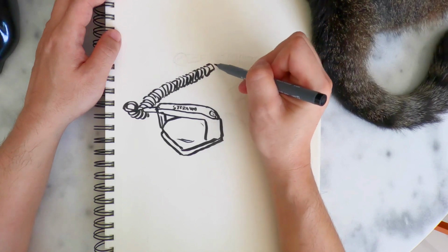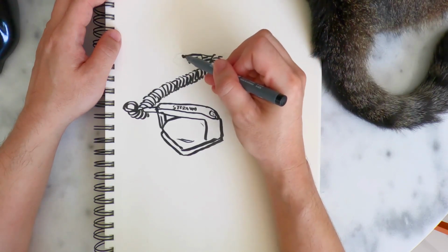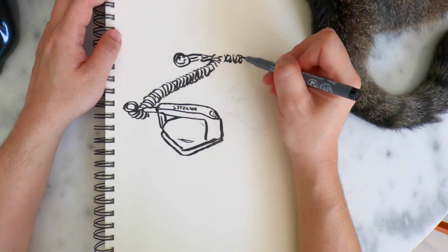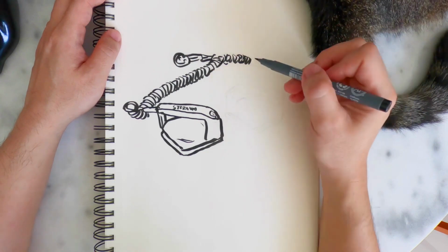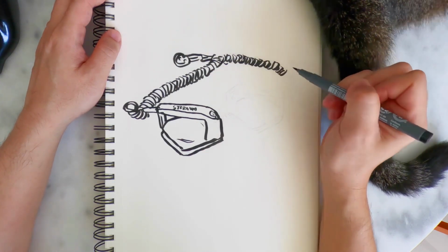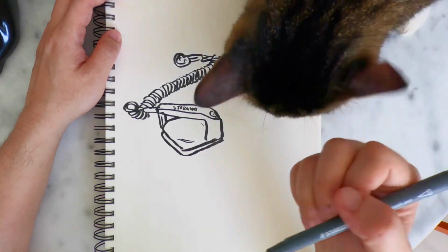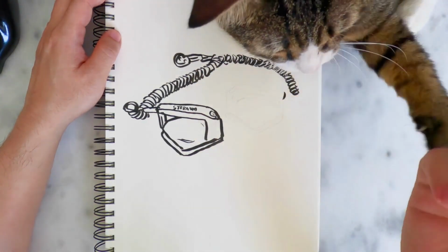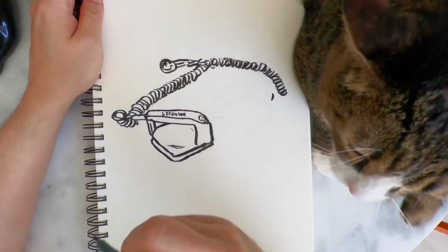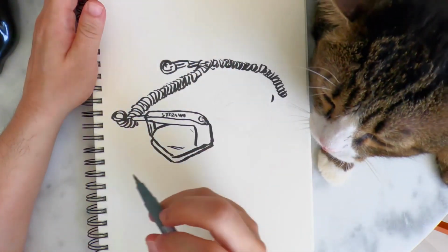The other pad is called the defibrillator pad, or shock pad. That pad is labeled, and I don't understand why they wrote sternum. However, when we place it, we don't put it directly on the sternum. We place it on the upper right area, which means we find the clavicle, right? Then just below the clavicle, we place the pad. The other one is labeled apex, which is located at the tip of the heart, on the left side, right below where the heart apex is. I'm sharing this because beginners might think it should be directly on the sternum as written, but in reality, it's not. This is something people have asked me, so I'm illustrating it for you.